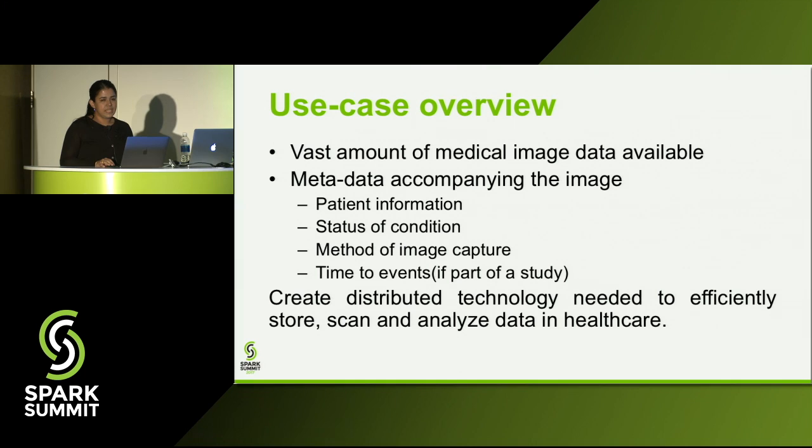And time to events. If you're part of a study, you might periodically come in to get these images and these metrics calculated. So maybe 1 month into a study, 2 months into a study, or maybe when you were diagnosed with the condition. So the main idea here is to create the distributed technology needed to efficiently store, because we have to store it in a format that's understandable, scan, and analyze data in healthcare.